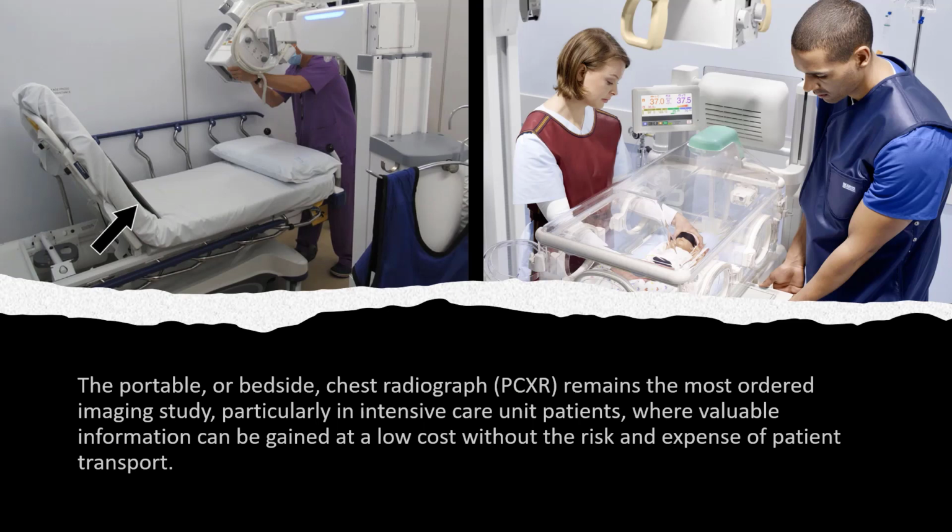Portable exams are inherently more difficult. Now, if we take a look at the image on the left, remember we talked earlier about tube part film alignment? Do you think there will be some distortion as this image receptor has a poor relationship to the tube and its alignment? Not only that, when you take the exam, we have to think about things like the patient needs to be totally upright at a 90-degree angle to get air fluid levels. If we're not totally upright, the air and fluid will spread out over the imaging area. When we put the patient in for a decubitus view, we need to leave them in that position for 5 to 10 minutes to allow air to rise and fluid to fall.